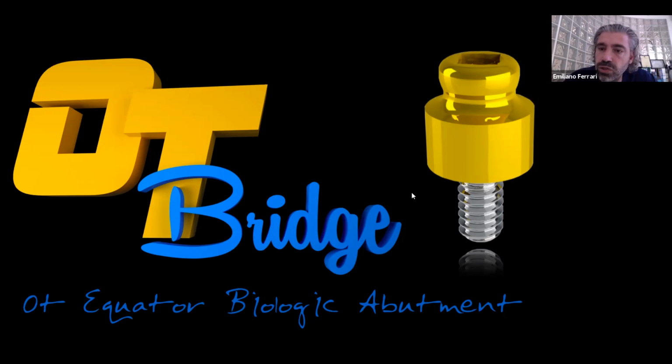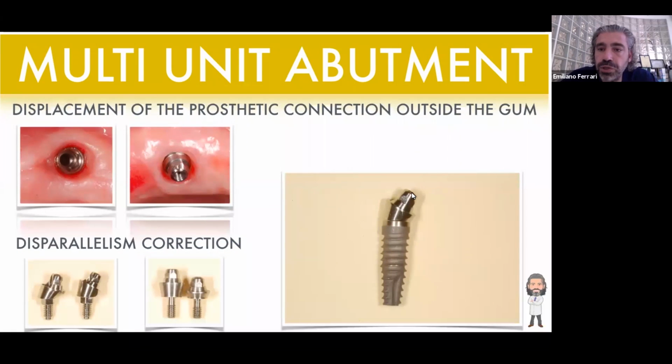So what you have to do is use multi-unit abutments. If you want to build a Toronto bridge or something like that, you can do this only using the multi-unit abutment.